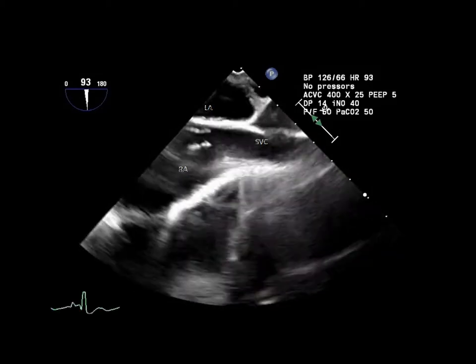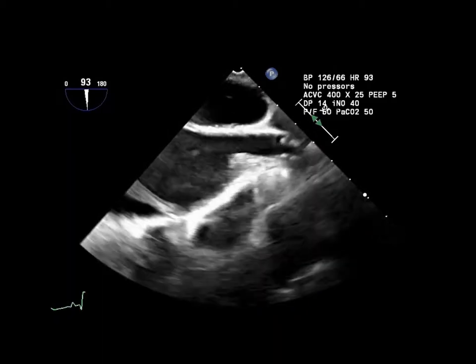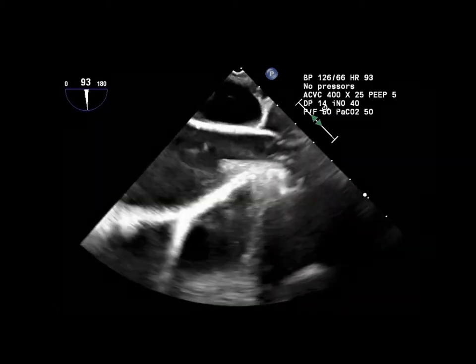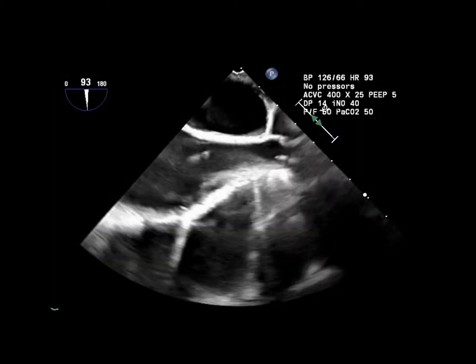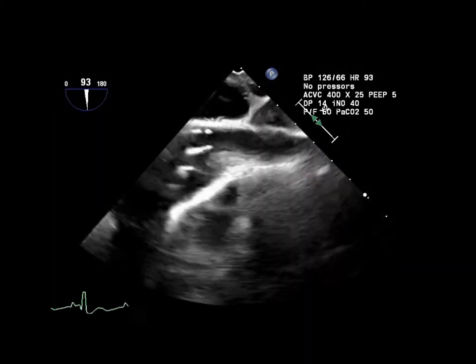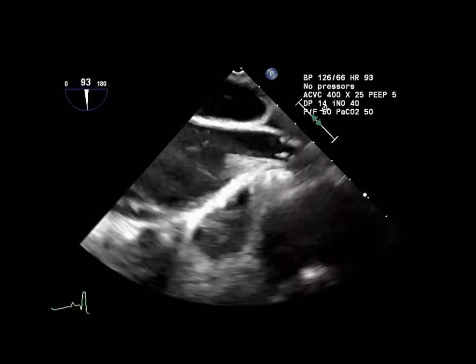And that's the reason why, as I mentioned before, we tend to put the drainage cannula much higher than what we used to do, because we expect that once the patient is on ECMO, we decrease the ventilator settings, we will have a loss in lung volumes. So when the cannula is at the IVC-right atrium junction, then your diaphragm will ascend in the chest, and at the end, your cannula is only in the IVC. And as soon as the patient starts to wake up, coughs, then you lose your flows completely. But when it's a bit higher in the right atrium, you have a little bit less of dropping flows when the patient is a little bit more awake.